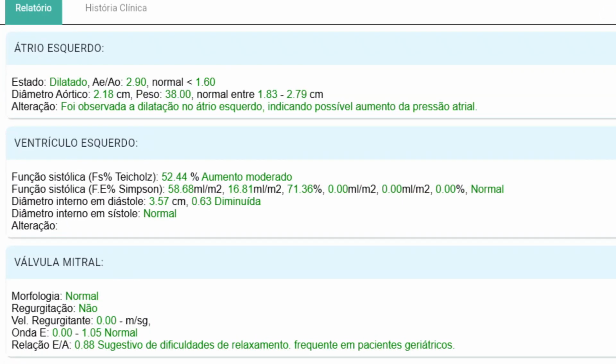In the left ventricle, the change is, measurements are consistent with a decrease in ventricular diameter, suggesting subclinical dehydration. Modification in the left ventricle has been applied. If you need anything else, I'm here to help. Lumini learns from daily interactions and stores dictated text to use in future exams.